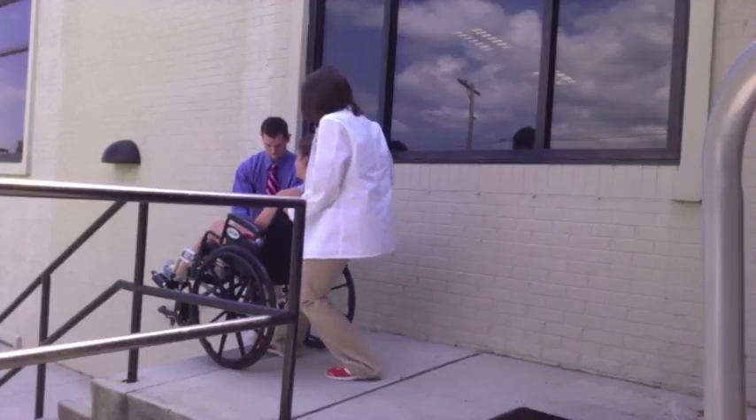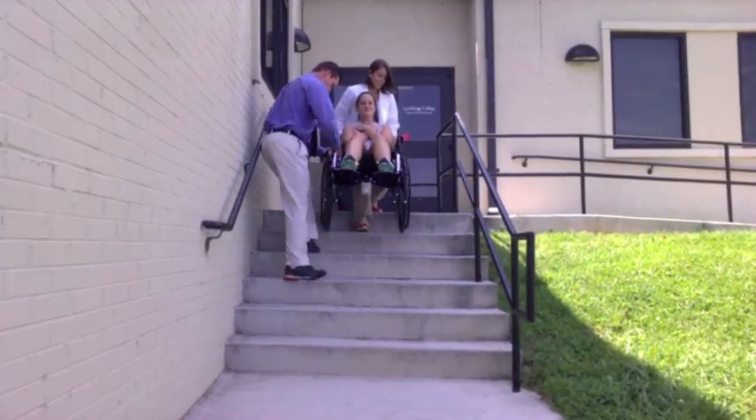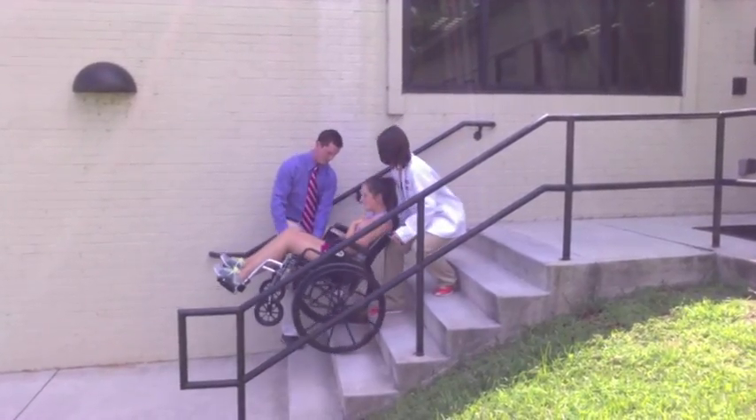Slowly and carefully, the clinician rolls the wheelchair forward until the drive wheels are at the edge of the step. On the count of three, all transporters work together to control and retard the motion of the rear wheels down to the next step. For the safety of the patient, it is imperative that both drive wheels roll down each step simultaneously.